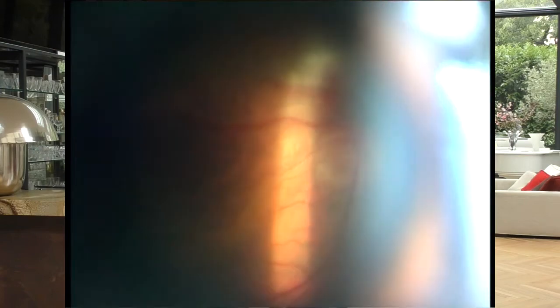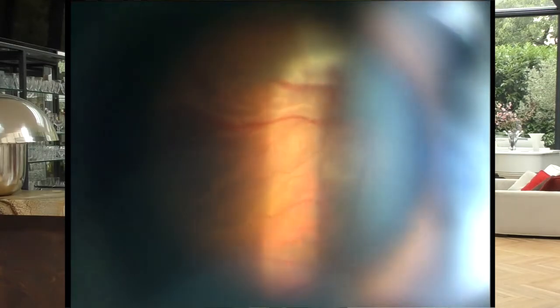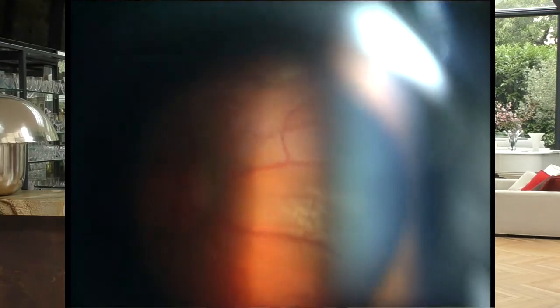I then used to systematically examine the posterior pole with a simple Volk lens without contact to look at the macula. Not so much to see if it was detached, because it never really influenced my strategy, but especially to see if a retraction syndrome could direct me toward vitrectomy.